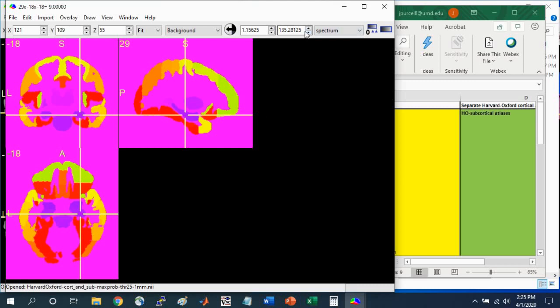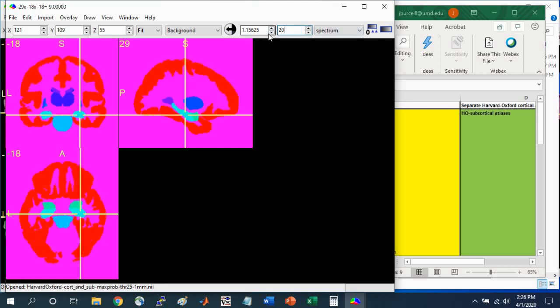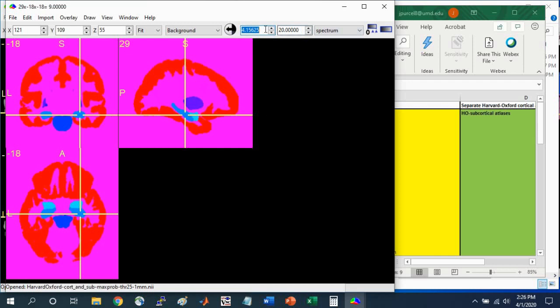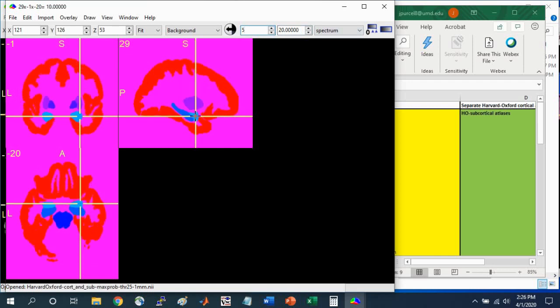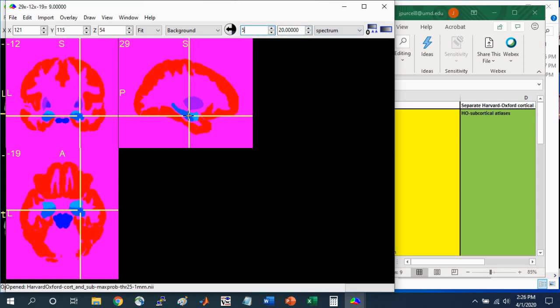You can play with the minimum and maximum intensity values to see these more clearly. If you focus on intensity values closer to the value of interest, in this case the hippocampus is 9, and now we're between 5 and 20, we can see it more clearly and dissociate it from the amygdala, which is 10. That's just a way to play around the intensity values and color scales to see these regions more clearly.